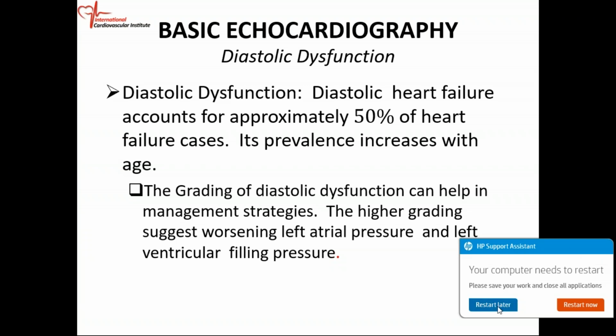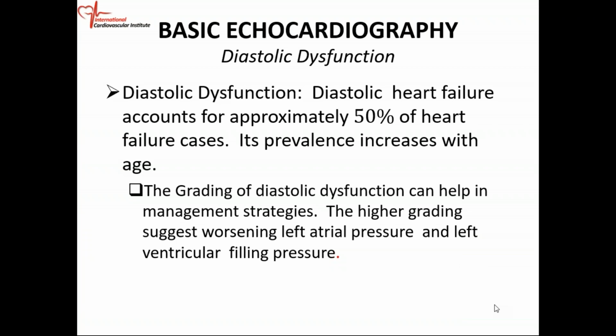And if we're going to evaluate a patient, we're doing an echo and we're going to evaluate the grade of diastolic dysfunction, there are 5 things you need to look at. And if those 5 things don't help you, then there are additional things that you can use. But when you see the patient in the echo lab and you're doing your assessment, look at these 5 parameters first.